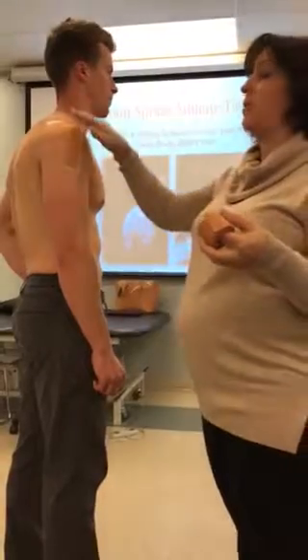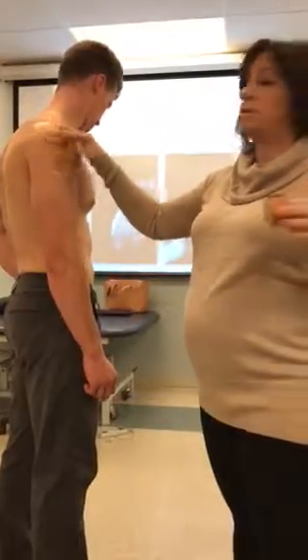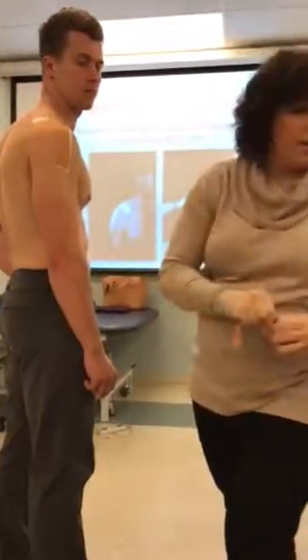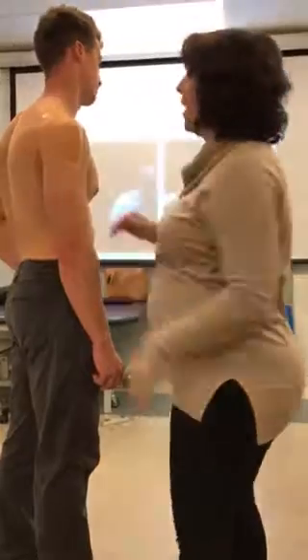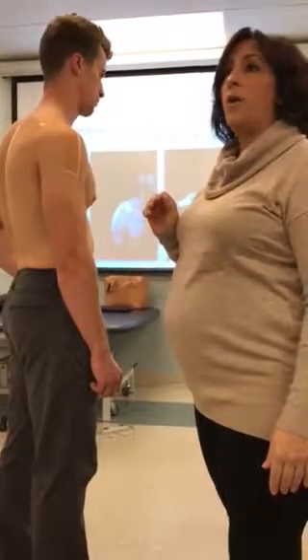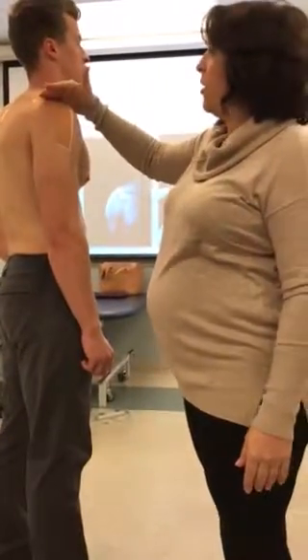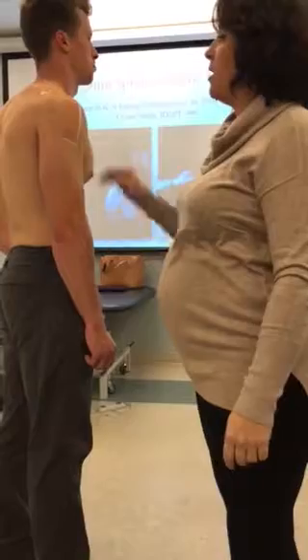But the old what they called brown tape could never touch the skin. That would rip that skin right off. This is much more forgiving for the skin. So even if you didn't prep and you thought, I still need more, you could just layer this and not even worry about adding those extra pieces of coverall, because you know that this is okay to be on his skin. So you can create the star like that if you felt you needed more support. A bigger shoulder might need maybe 3 strips to cover along that AC joint, and then start doing your pieces. Does that make sense? Okay, so that's AC joint.